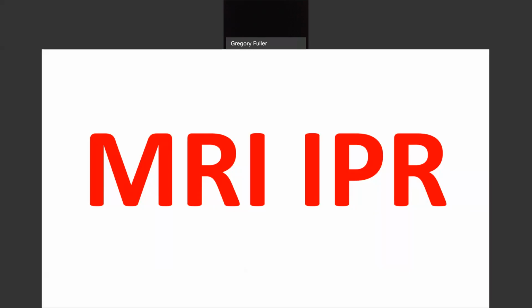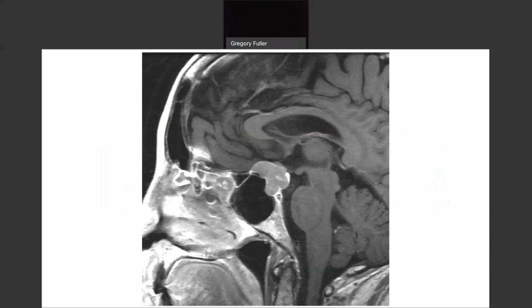Okay, everyone ready to play? I just want to know, what is the most likely diagnosis based on the imaging morphology? Imaging morphology works exactly like pathology morphology. Same. Okay, everybody ready to play? Here we go. What's your diagnosis? I'm going to give it here. I'm sure we have easily 10 or 15 seconds to spare. So I'm going to type in, what is number 1 on your differential diagnosis list based on the imaging morphology?